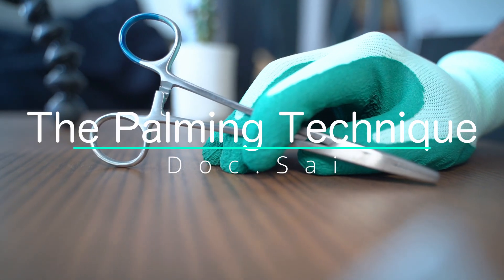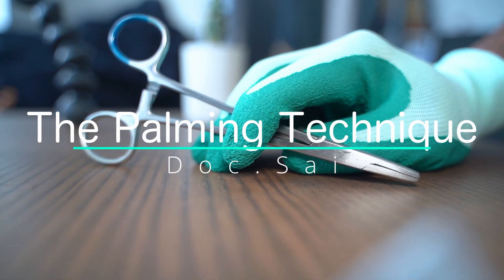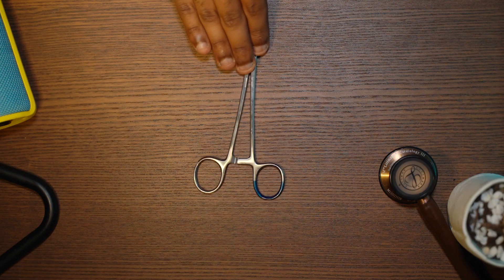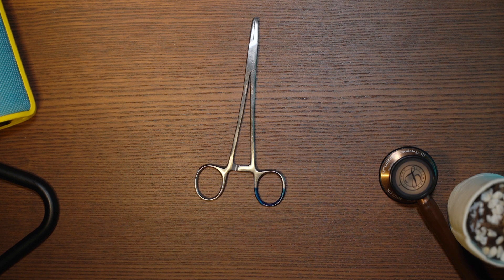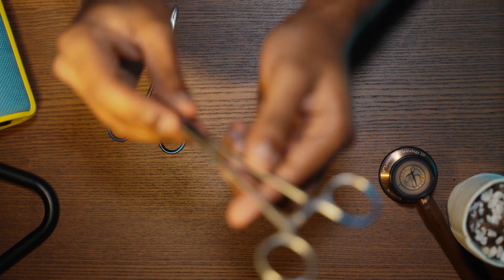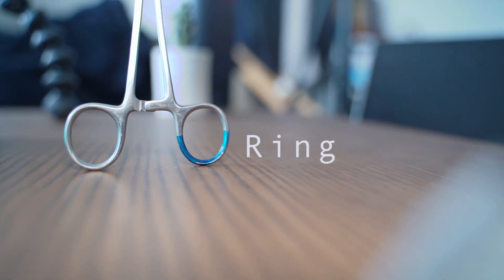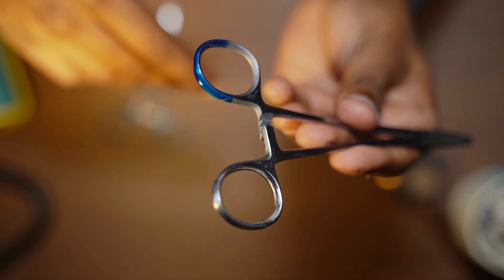Let's go. The first thing we should go over is the anatomy of the actual needle holder, also called the needle driver. This is your needle holder, and this is your smaller, cuter needle holder. At the top we have two rings in which you can place your thumb and your ring finger.